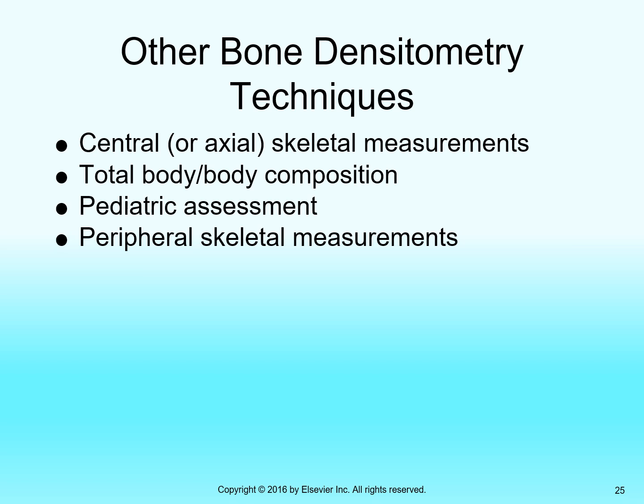on my part given what I understand about the physics and how the analysis is performed. It's measuring for differences in attenuation. Well, a diabetic foot is going to have effusion and chronic inflammation, and so it's going to affect attenuation. And so, does that have to be accounted for in the fudge factors and the mathematics? I think it does.